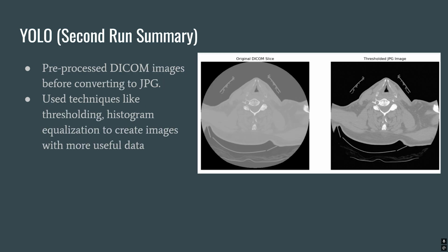For our second run of YOLO, instead of converting raw DICOM straight to JPEG, we pre-processed the DICOM images. We thresholded them, finding the range of HU units that was best.